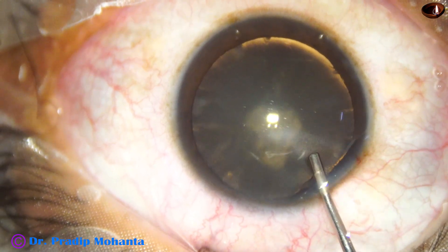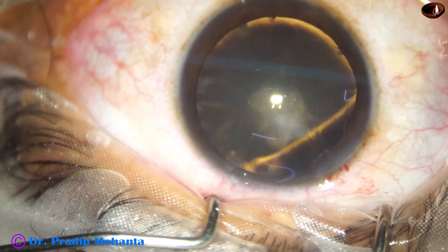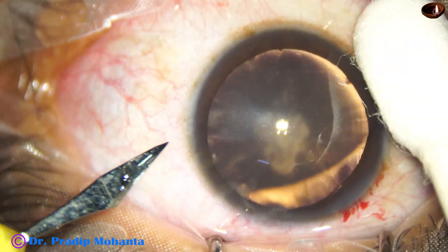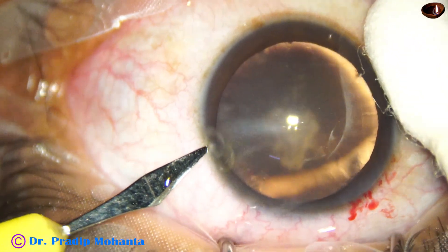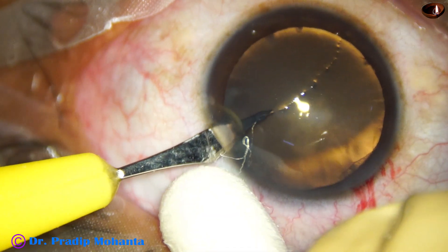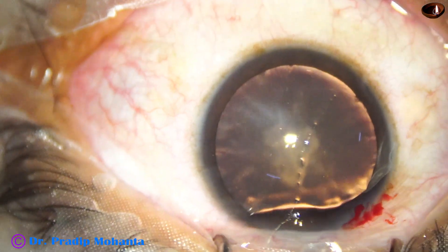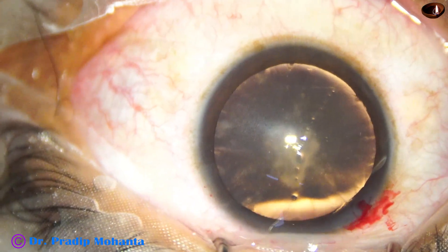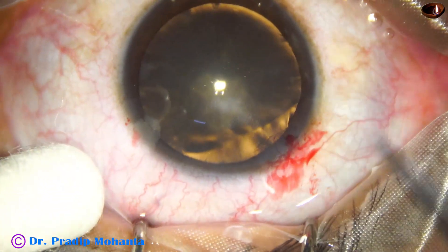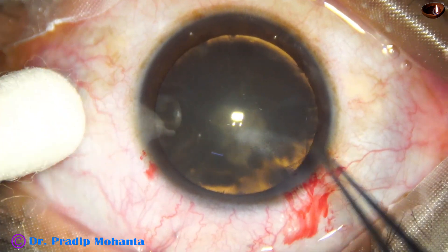The anterior chamber is filled with visco. Now capsulorhexis is to be done. Before that, this is a side port on the left side of the main incision, about 3 o'clock hours away. And now, capsulorhexis.